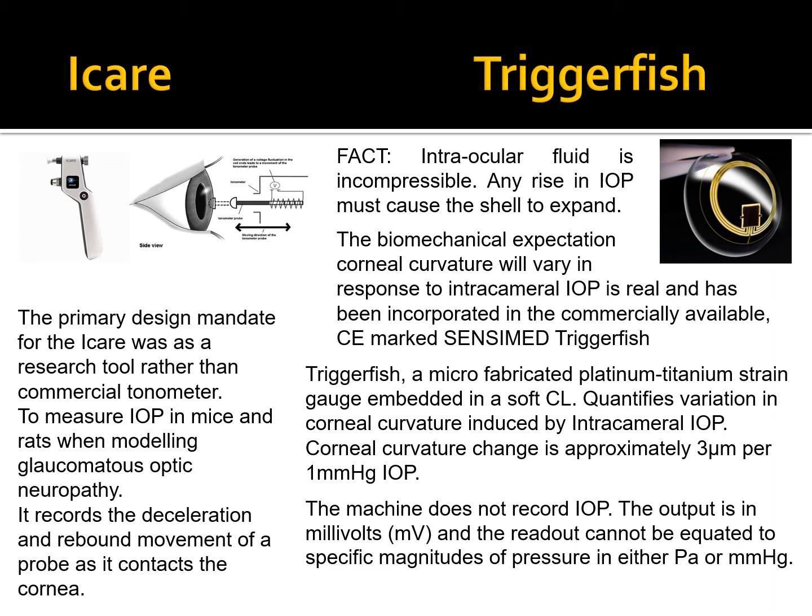So it has a microfabricated platinum titanium strain gauge. So the DCT uses Pascal's law of hydrostatic pressure. This uses an equally valid concept of the shell changes.